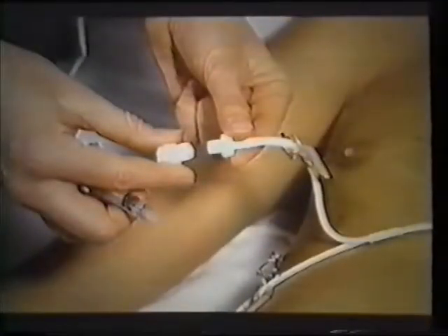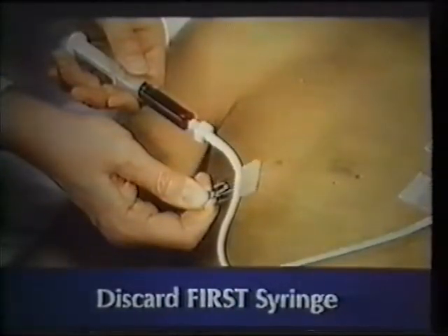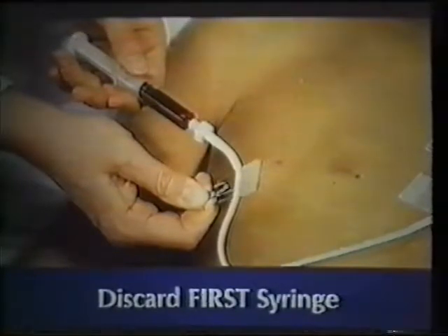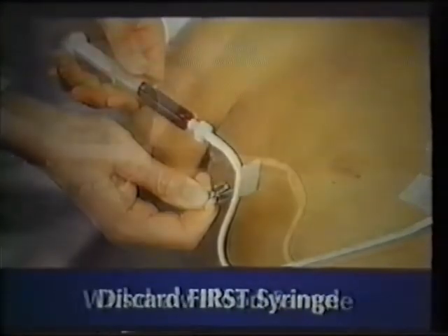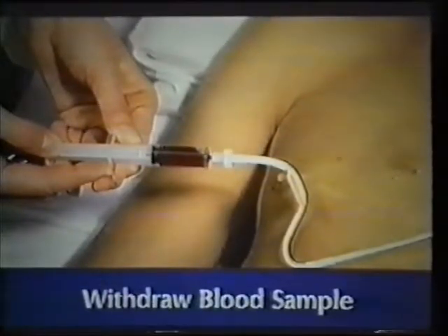If a heparin lock is in place, remove the tape and cleanse the connection, then remove the cap and attach the 6 milliliter syringe. Remove the clamp and draw up 6 milliliters into the syringe. This purges the catheter of any solution which could contaminate the blood sample. Re-clamp the catheter and remove the 6 milliliter syringe and discard it. Connect the new syringe for blood sampling, remove the clamp, and draw up the amount of blood needed. Replace the clamp and remove the syringe.